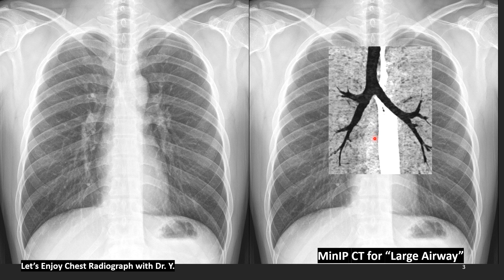This image is a MinIP projection of chest CT, which means Minimal Intensity Projection. That means the lowest Hounsfield unit of air is black, so it can easily show us the large airways. Here is the trachea, right main bronchus, apical bronchus, bronchus intermedius, right middle lobe bronchus, lower bronchus, and left main bronchus.